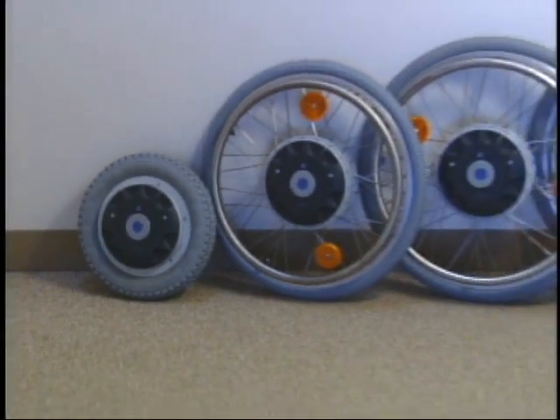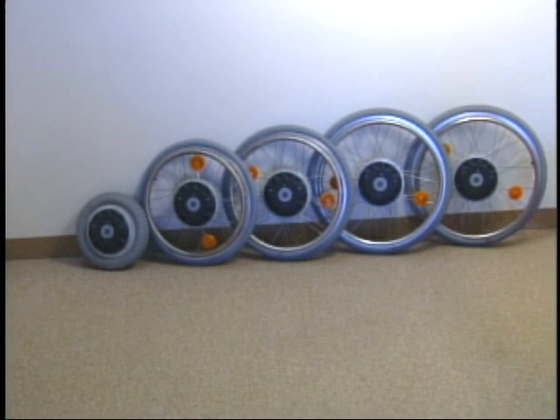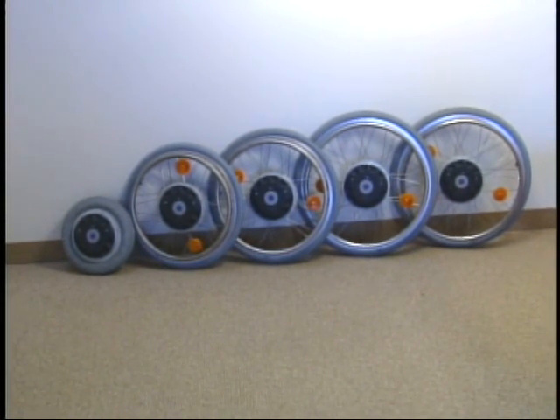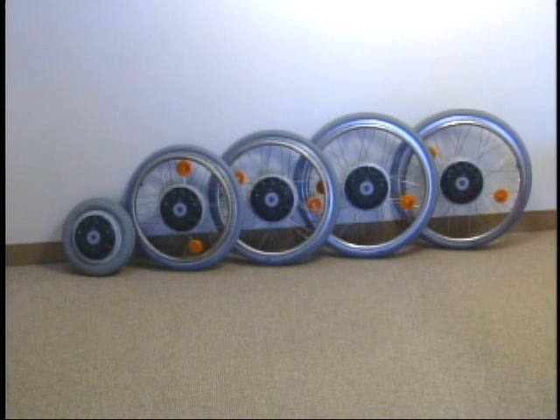E-Fix wheels are available in five different sizes: 12, 20, 22, 24, and 26-inch wheels. Solid, flat-free inserts and stainless steel push rims are standard features.